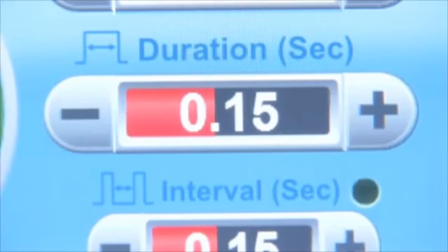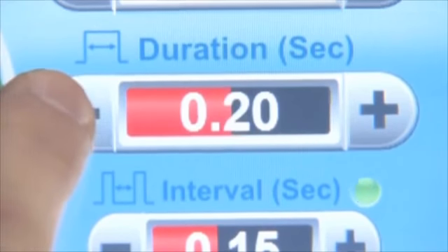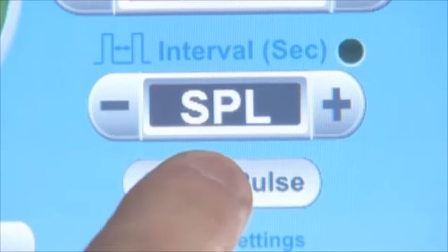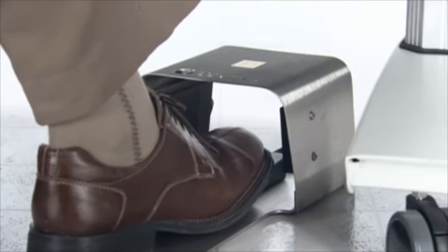The exposure duration is the duration of the laser exposure. See specifications in the maintenance chapter of your operator's manual for the available settings for your laser. When the interval is set to SPL, single exposure mode, laser exposure stops after the selected duration has elapsed. Even if you are depressing the foot switch, when the interval is set to a value other than SPL, laser exposure continues until you release the foot switch.